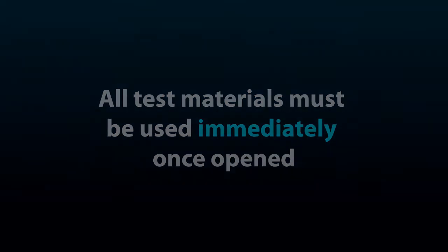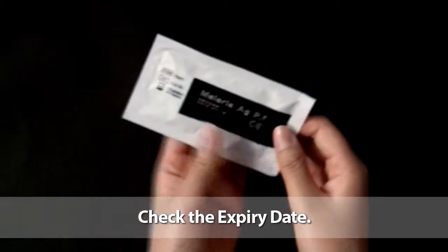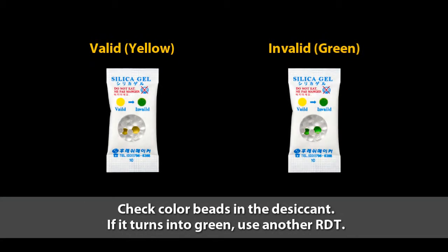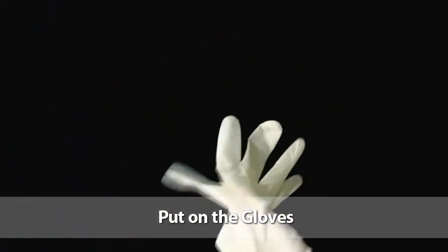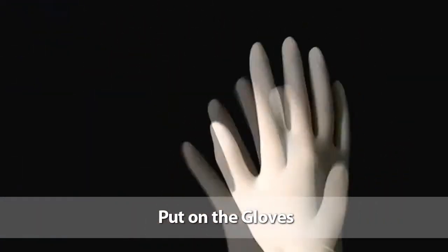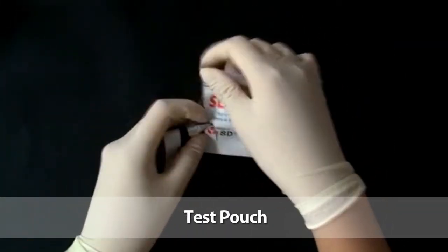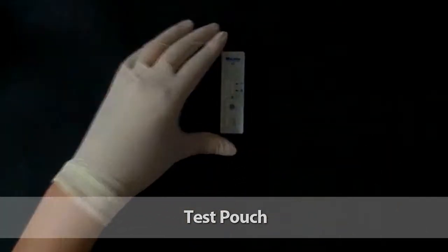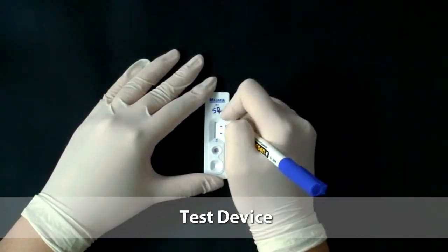Let's begin the test. Check the expiry date on the back side of the test pouch. If the expiry date has passed, use another kit. Put on the gloves. Remember, use new gloves for each patient. Open the test pouch and set the test device. Write the patient's name on the device.